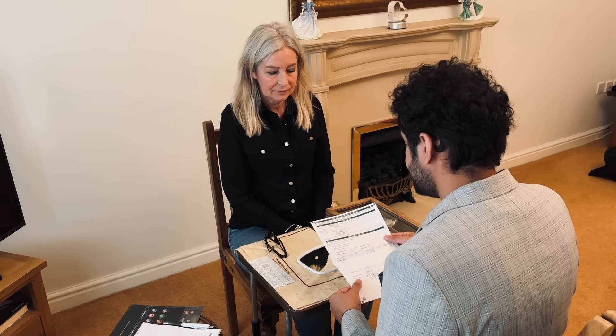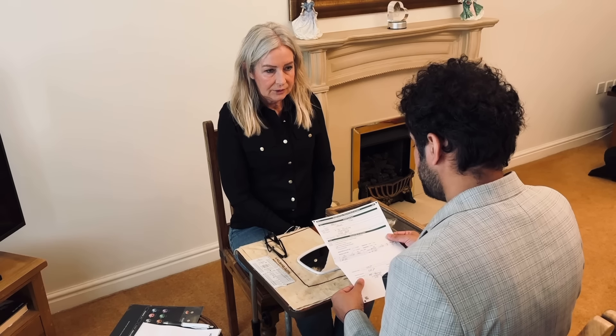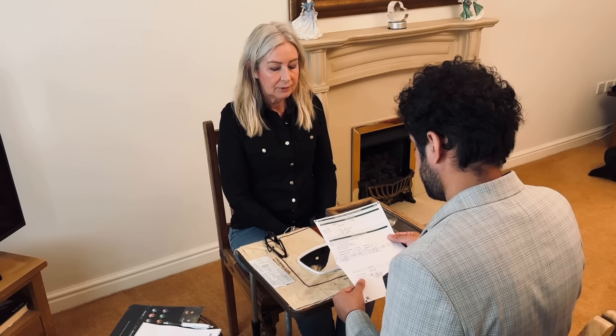So do you just wear reading glasses at the moment? Yes. Right, okay. And you're quite happy with your distance vision? Yes, at the moment it seems to be okay. Okay, now your reading glasses are not like a bifocal or a varifocal, they're just purely reading glasses.